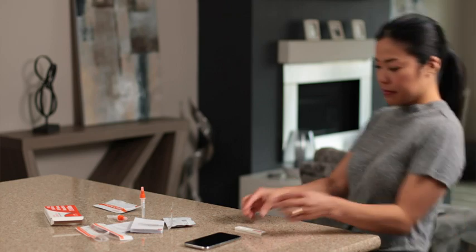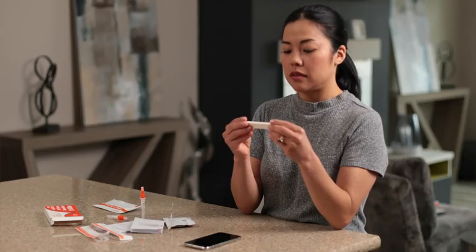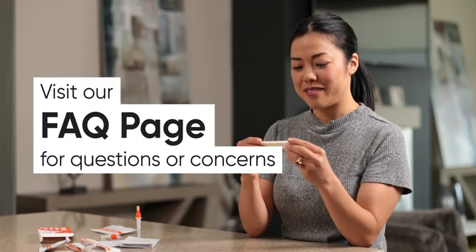And that's it. If you tested positive, don't panic. Seek advice from a medical professional on your next steps. You can also go to cdc.gov for more information about how best to keep yourself and others safe. If your test is negative, be safe.